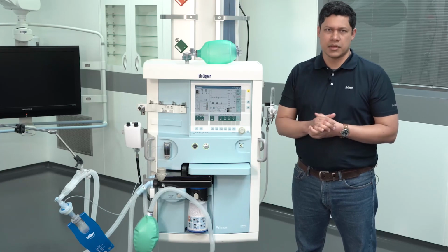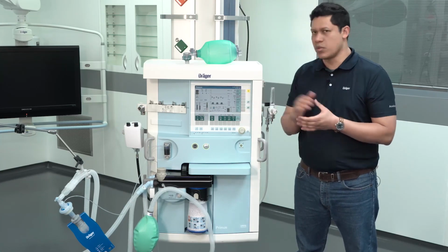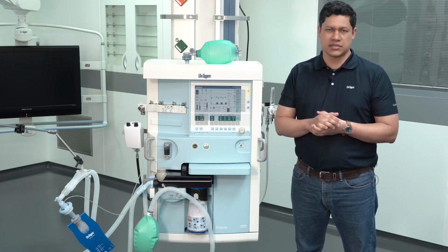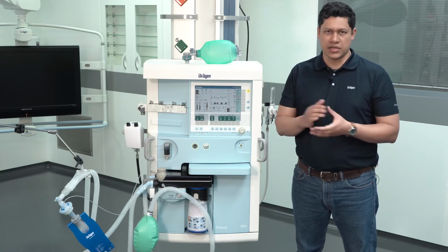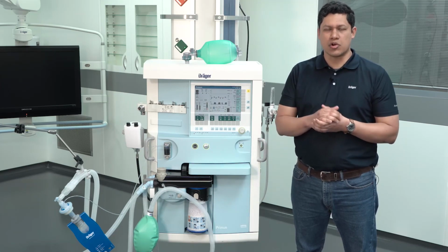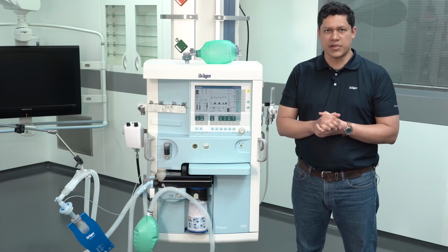Please remember, the alarms on the display will be deleted automatically once the condition triggering the alarm has disappeared. To verify alarms that have occurred in the absence of the user, you can always go to the logbook and verify them directly in there.